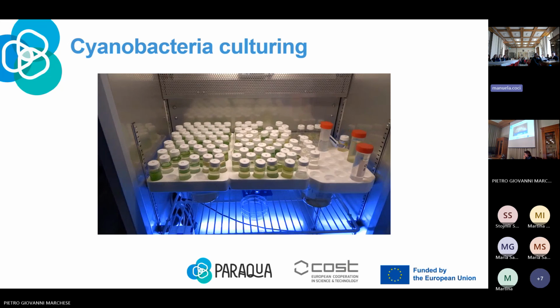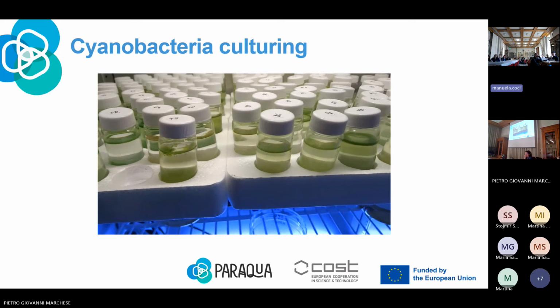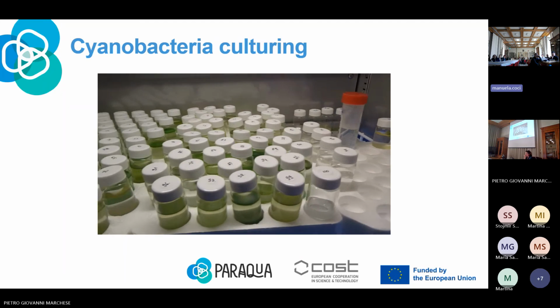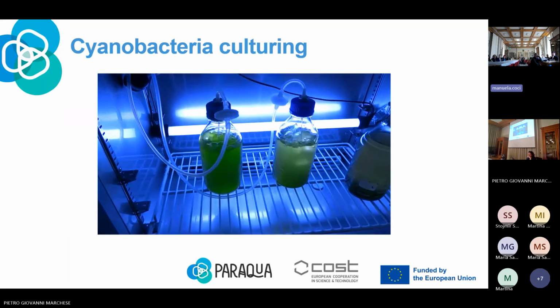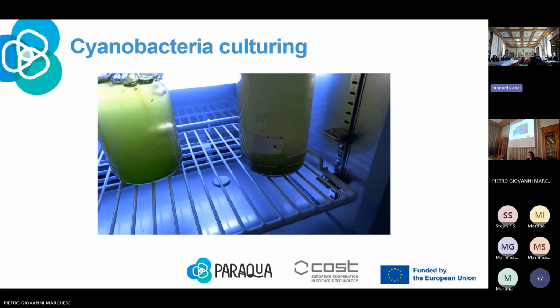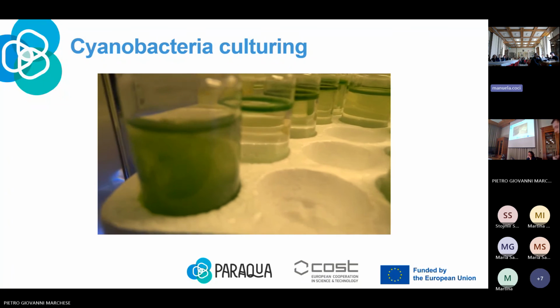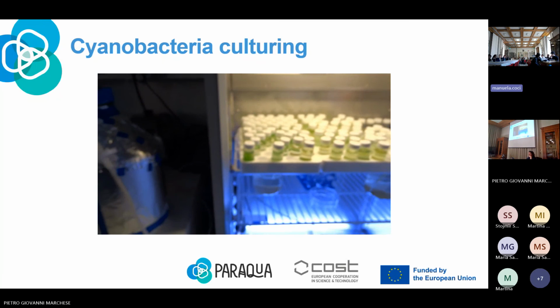And if we were super happy and super successful with isolation of cyanobacteria, and the number of strains is very high, we should think how to reduce our time spent on taking care of the cultures. So in this case, batch culturing and the reduction of the size of bottles, the volume of the media, is a very crucial step. So I use small 20 milliliter bottles for cultivation, and I'm responsible for the whole process.